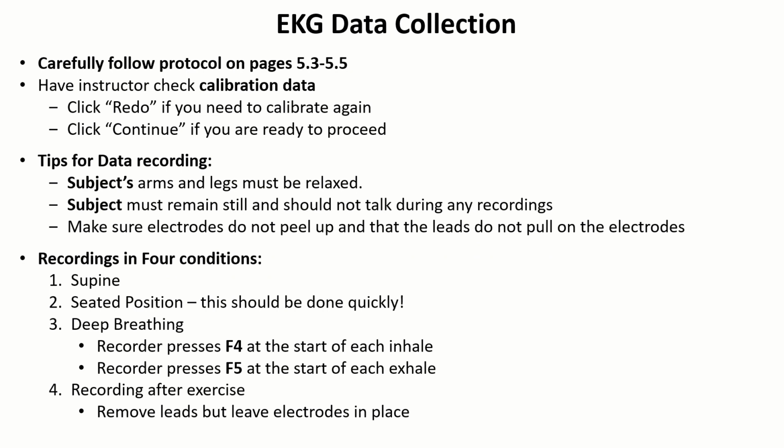For the data collection, carefully follow the protocol on pages 5.3 to 5.5, relying on the reader in your group to lead you through each step. You must calibrate the software at the very beginning and have your instructor check this calibration data before you move on. You'll click Redo at the bottom of the page to redo calibration if necessary, but if your calibration is good, you can click Continue to move into the actual exercise.